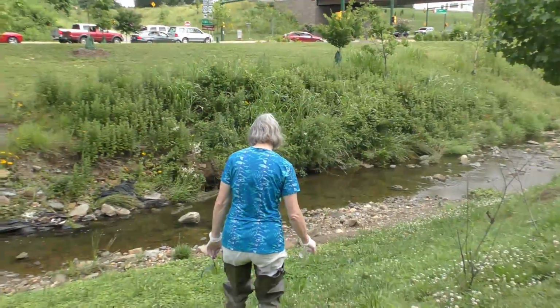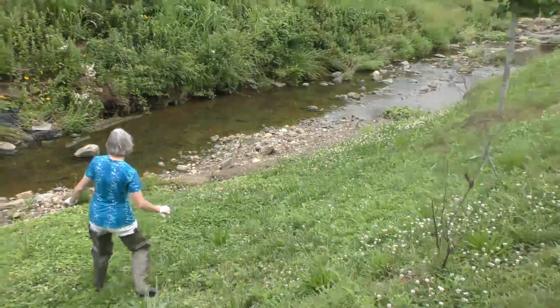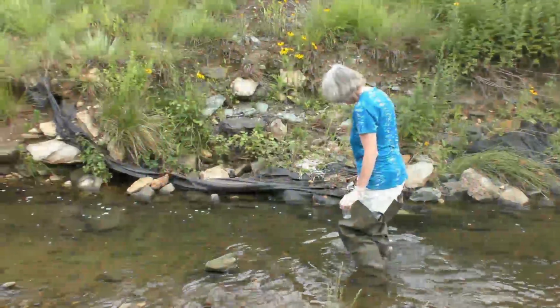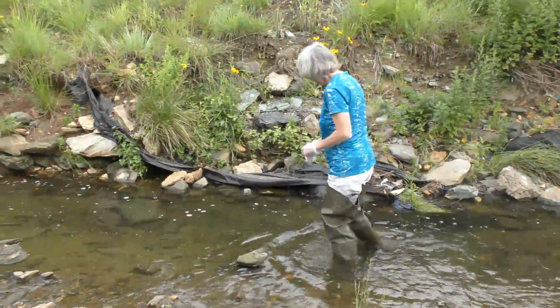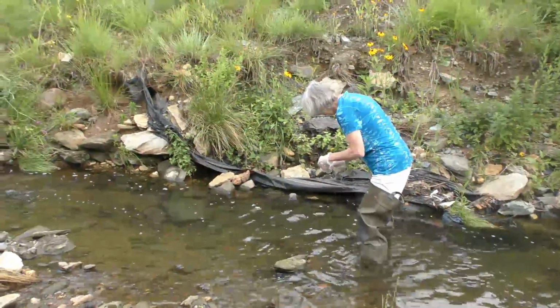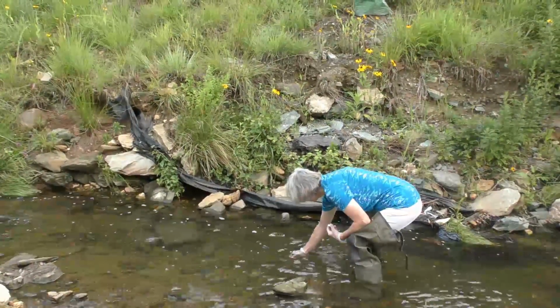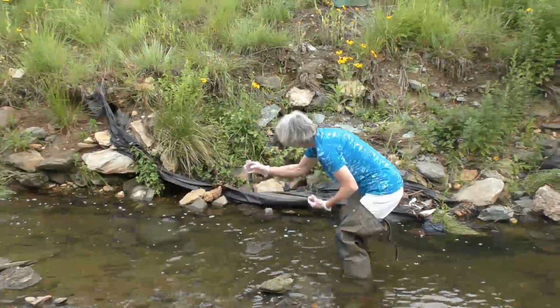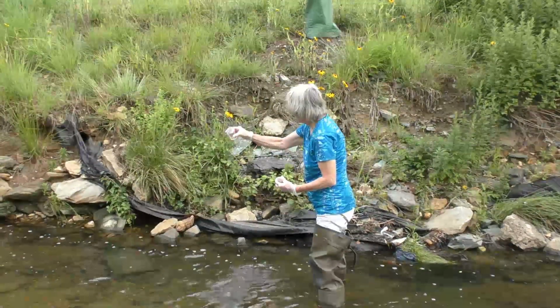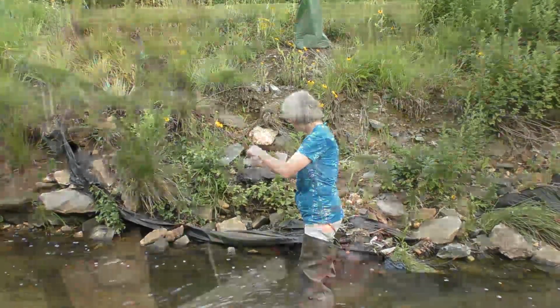If collecting samples by wading, it's important to enter the stream downstream of where you're going to be collecting your sample and wade upstream. This is to avoid any disturbed sediment from entering your sample bottle, producing an artificial result. Here you see the volunteer scooping a sample by moving the bottle away from them towards upstream. That's so the bacteria that flows into the bottle is from the upstream source.